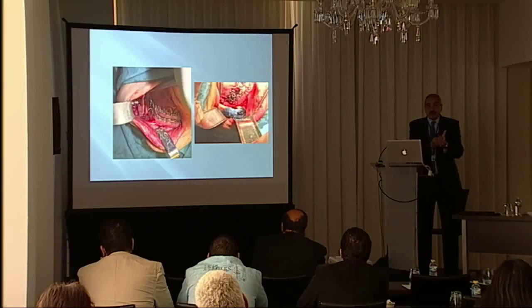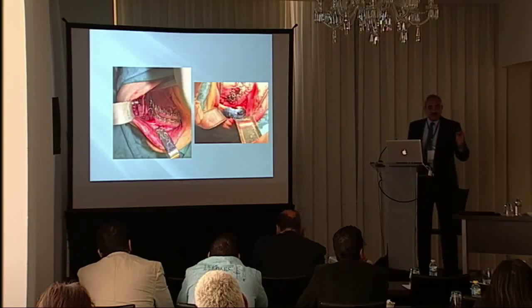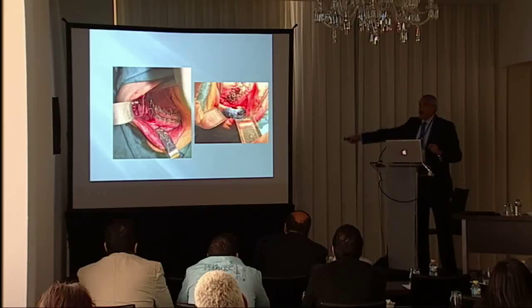And we thought that we were doing a good thing, but when we tried to adjust the condylar position exactly on the computer, I found out that, especially in setbacks, but even in mandibular advancements, you have a space in between the segments.